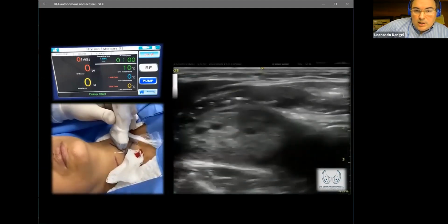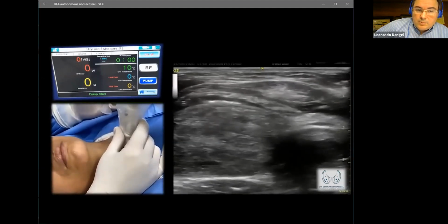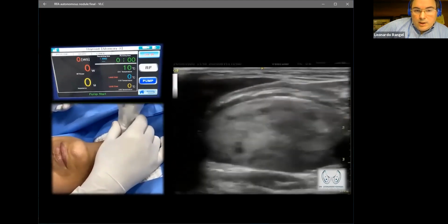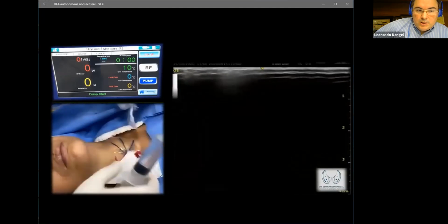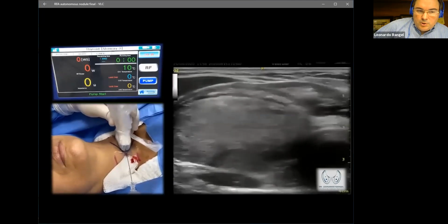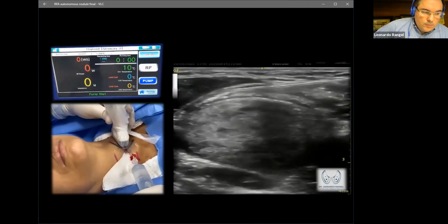And sometimes that's when we use the spinal needles that are longer, sorry. For the hydrodissection, sometimes we can go from lateral if needed. If the nodule is too bulky and we cannot go over the nodule, there is not a problem to go lateral with the spinal needle and try to get the carotid space away from the nodule. But generally we go from the same site and use the same skin puncture so the patient does not feel several skin punctures and stings.